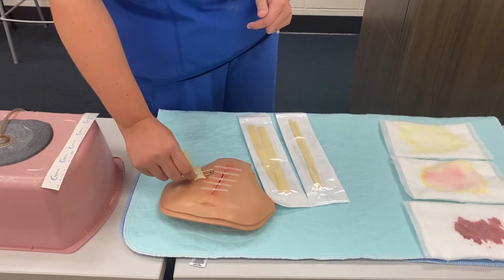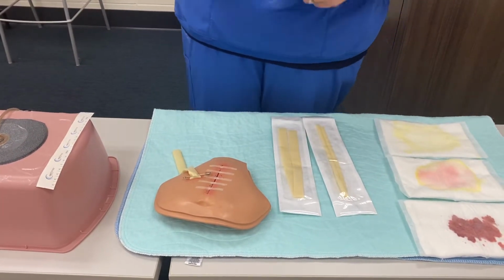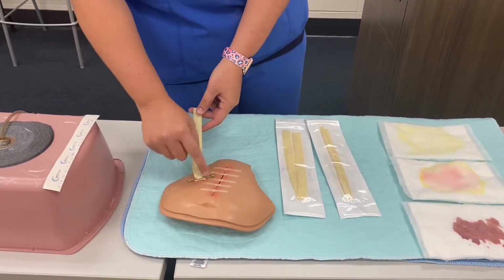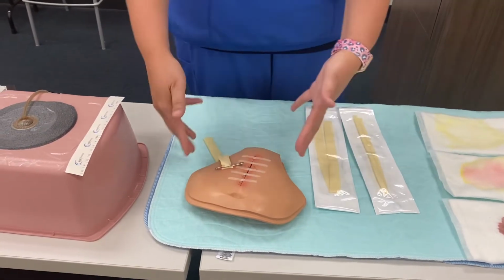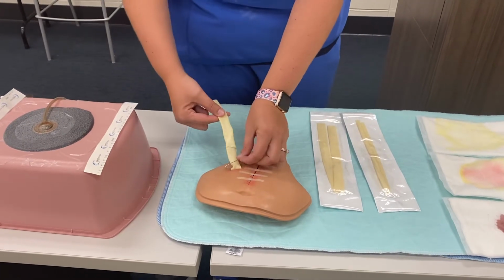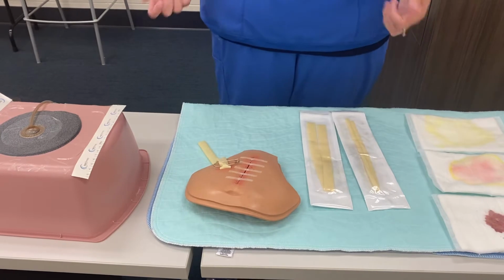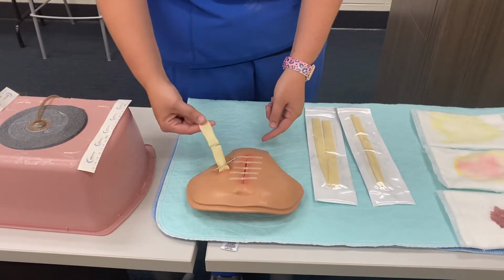It does have a safety pin on it, and that safety pin just allows you to know the location of the Penrose. Okay, so I know right now the safety pin is at the mark of the incision. If I come in 2 hours to reassess my client's abdomen and I note that the safety pin is way down here, okay, it lets me know that this drain has been pulled out just a little bit. Okay, so I would want to make someone aware that it has come out some.